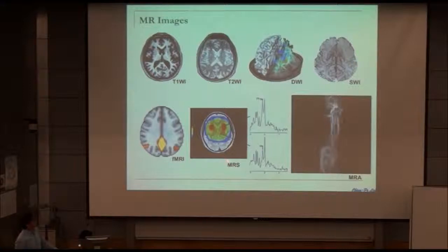And MR spectroscopy is the technique that can detect local frequency change based on the underlying chemical source. And this is MR angiography. Then we can see the vascular system. So actually, MR has different ways to detect different kinds of sources. But due to time limits, I will only introduce T1 anatomy information, diffusion that can be used to detect neuron tracks, and also functional MRI.